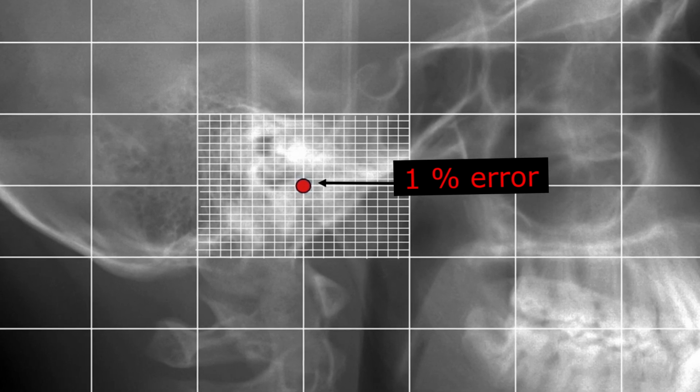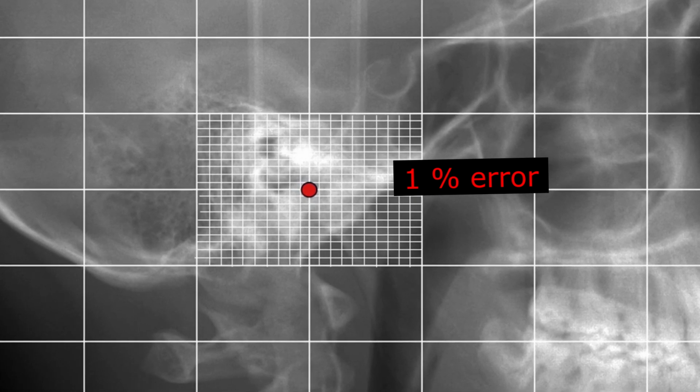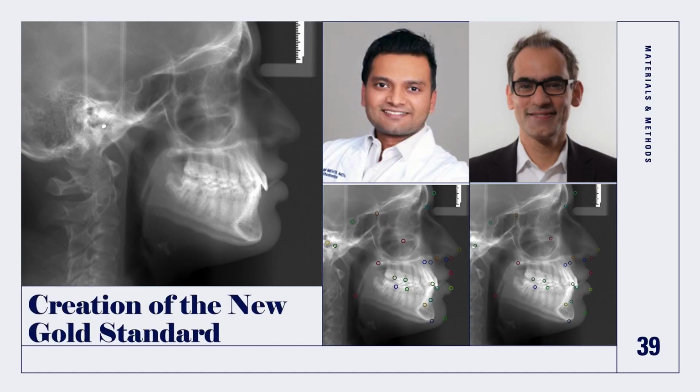We believe this is a better method for measuring error in future research because it lends itself well to multi-center studies and solves the problem of error increasing as resolution increases. So the aspirational goal for this study is to create an algorithm that has an error rate similar to human experts, and in order to do that, a gold standard for human inter-expert variability needs to be established. So to accomplish this, 2 experts each annotated an identical batch of 300 x-rays, and the inter-expert variability was measured. Combined, the experts had over 20 years of experience using lateral cephalograms in clinical diagnosis and treatment planning and considerable experience with research work involving cephalometric parameters.